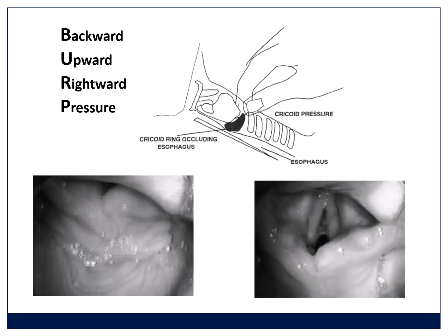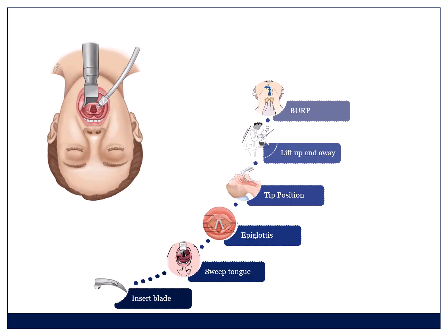I often do the burp maneuver myself while my left hand is on the laryngoscope. I pull the larynx over to the right, and then I get the assistant to hold it where I want them to hold it. So this is a maneuver you should use every single time you haven't got a good view. So that's the burp maneuver, and then the next thing you do is you watch the tube go through the cords. It's a common problem you see the cords nicely, you bring in the tube, and then you obscure the view, and then you push and you think it's gone through, but you haven't actually seen it go through the cords. So if you're not watching it go through the cords, you need to adjust your technique.